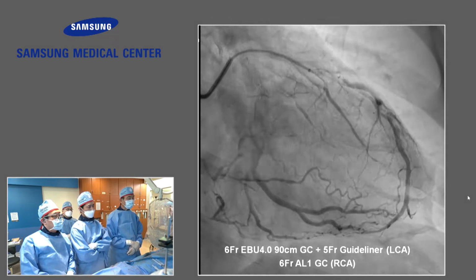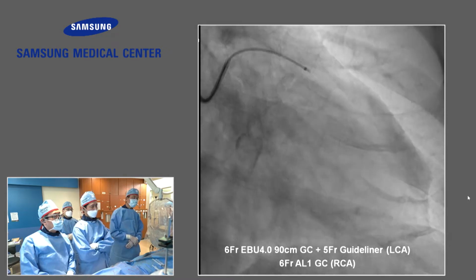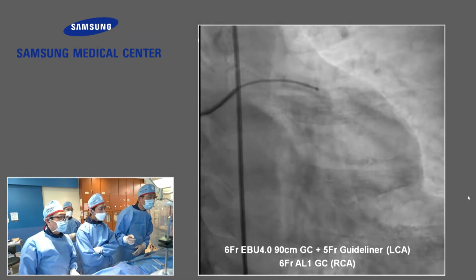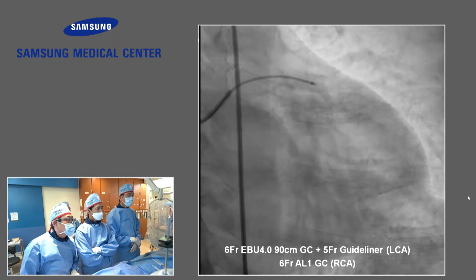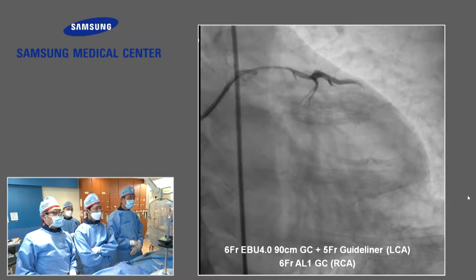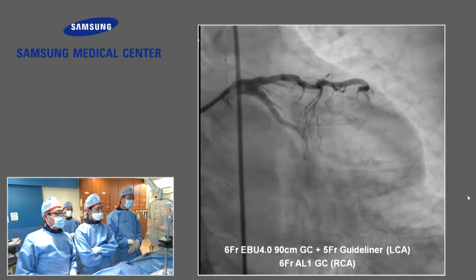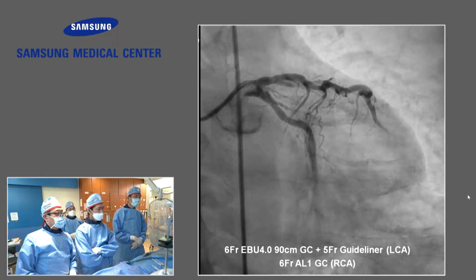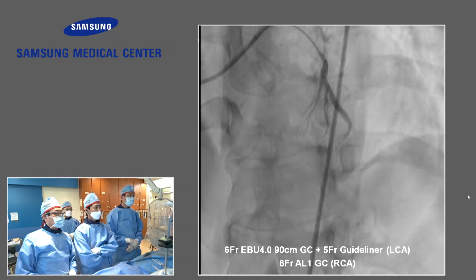The third septal branch can be used for collateral, but as you can see here, it's quite tortuous. The size is okay, but quite tortuous. And the epicardial collateral from the distal LAD is also very tortuous. So nobody prefers the retrograde approach, but we cannot exactly see the antegrade angiography.